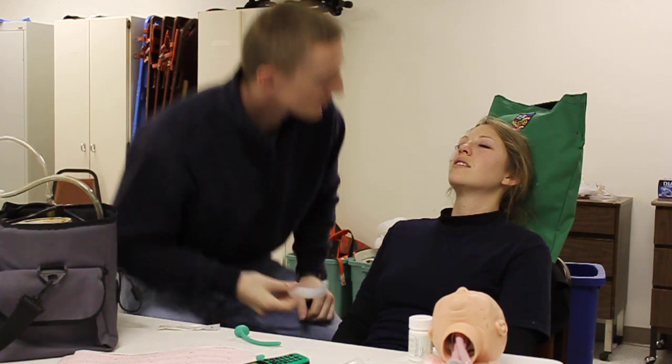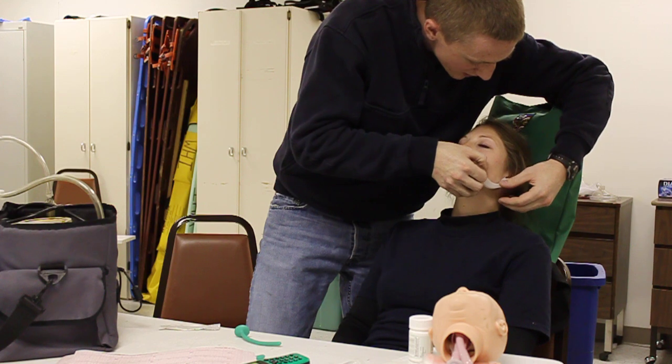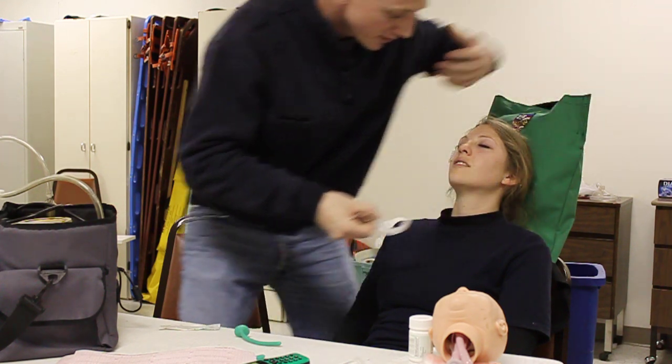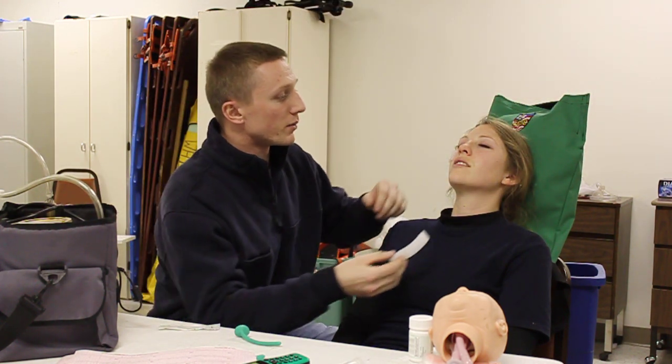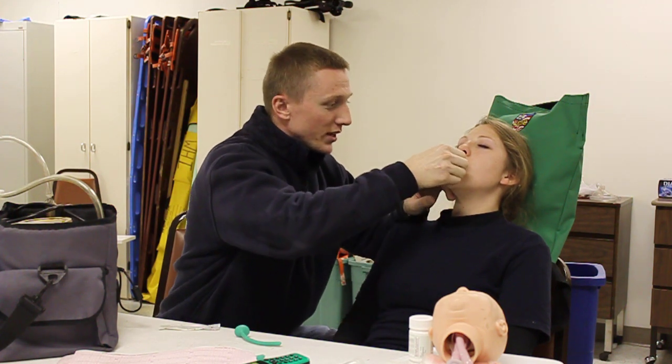I'm going to go ahead and insert an OPA. I'm going to measure off my OPA from the corner of the mouth to the tip of the earlobe. Once I have the correct measurement, I'm going to go ahead and insert at a 90 degree angle, then rotate down.